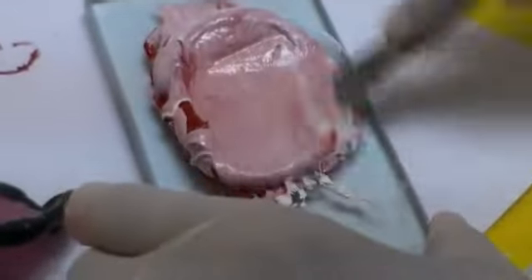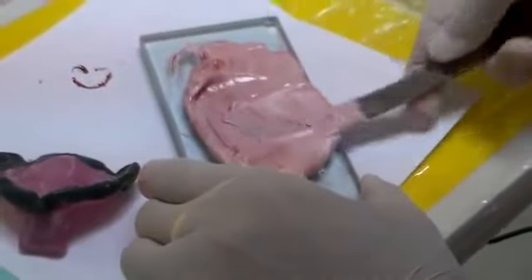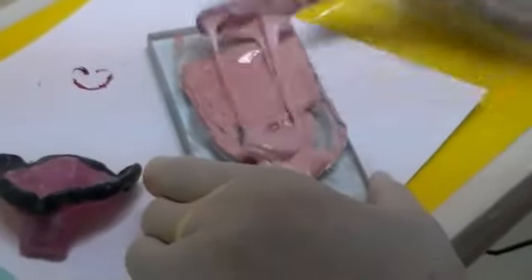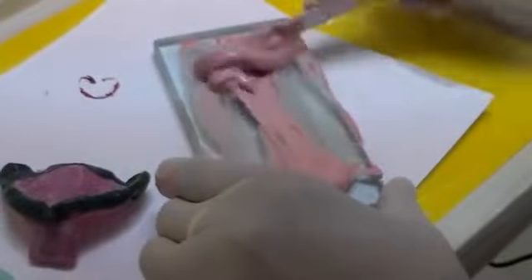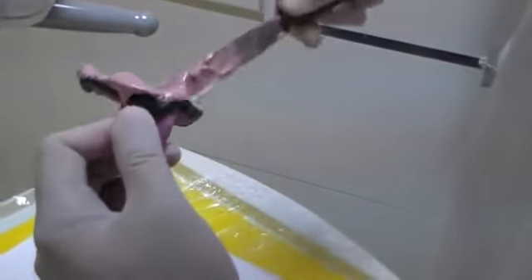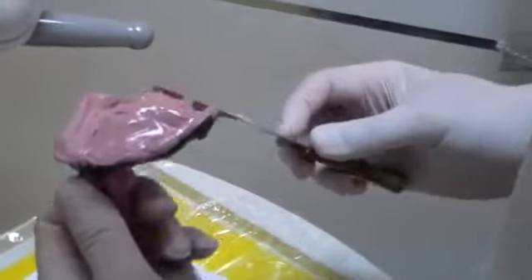Using a glass slab and a compression spatula or a flexible flat-plated spatula. Once you don't have any more streaks in your mix, you can start loading. You want to load it from the sides. I like to load it onto my borders, and then I like to load it onto the body of my tray.